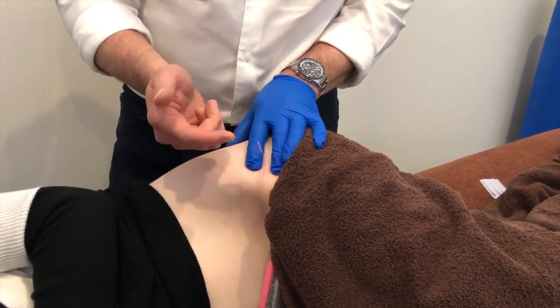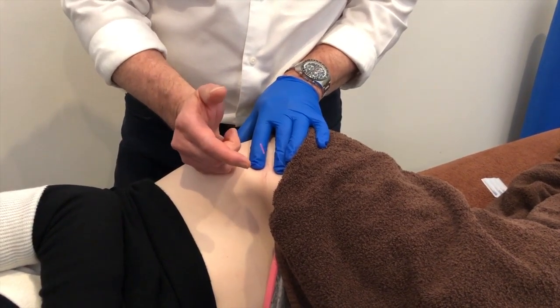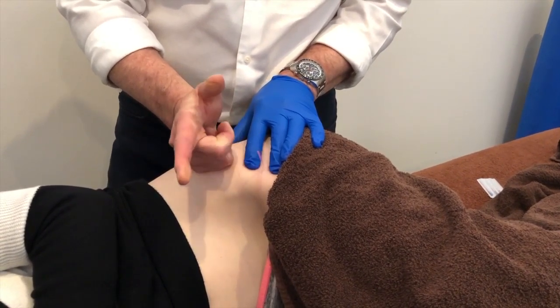So what you can do is get closer to the handle here, and rest this finger right here and only have these 2 fingers here at the bottom of the handle. Once you do that, then we can go straight in, no problem.